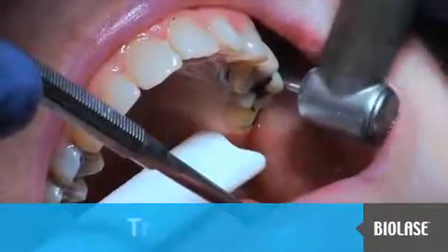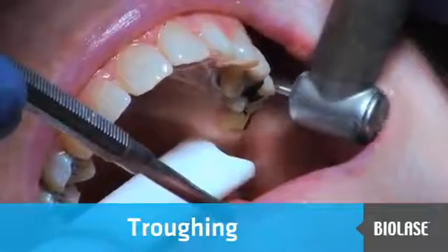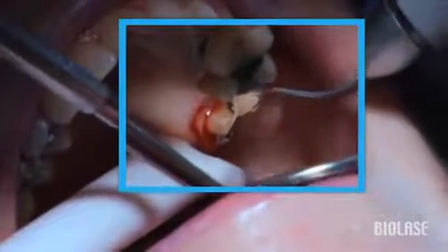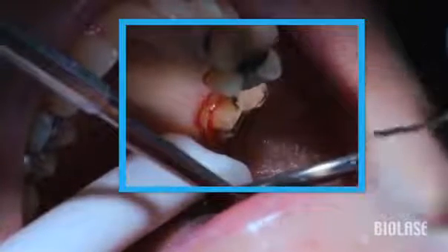In this case, we are using the WaterLase to trough the tissue for an upper first molar being prepared for a crown. We had recently completed a root canal on this tooth, and it had a very large MOD amalgam with a deep margin on the mesial. After removing the alloy and decay, the margin on the mesial was within 1 millimeter of the supporting bone.